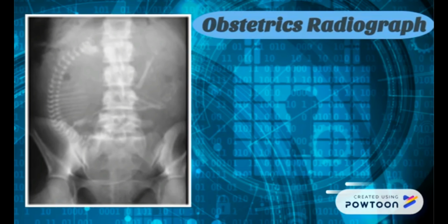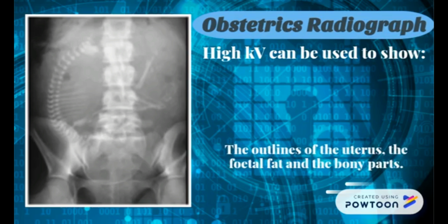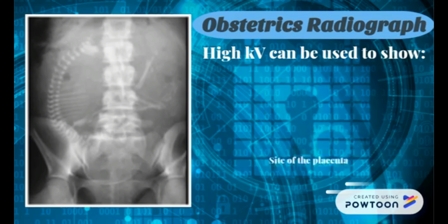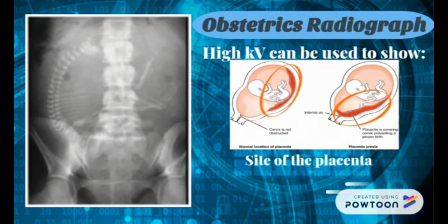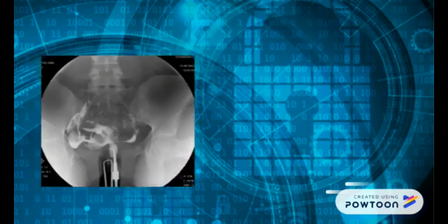In obstetrics radiograph, high KV can be used to show the outlines of the uterus, the fetal fat and the bony parts, the site of the placenta, and significant fetal abnormalities.